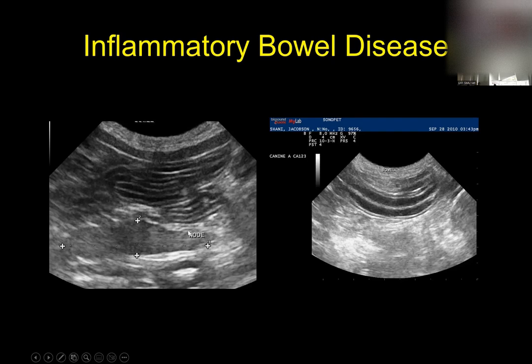Okay, and that's typical for cats and dogs with inflammatory bowel disease. The key is you have to recognize the thickening of the outside black line is abnormal. However, the definition of the layers is still intact. Okay, we can still see the edges of these layers. The thick outside black line is too thick, but the layering is still intact, still well defined. Okay, so that's a typical inflammatory bowel disease of a cat. They get a thickened outside black muscularis layer of their small bowel, and most of them will have some reactive lymph nodes. Typical IBD in a cat.